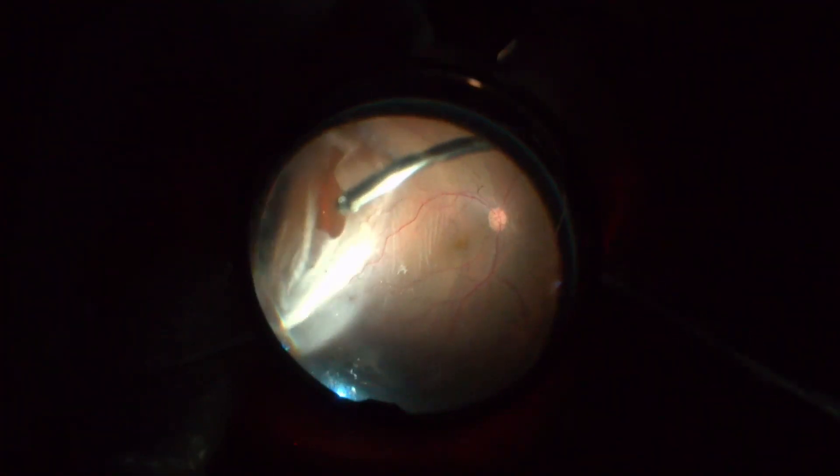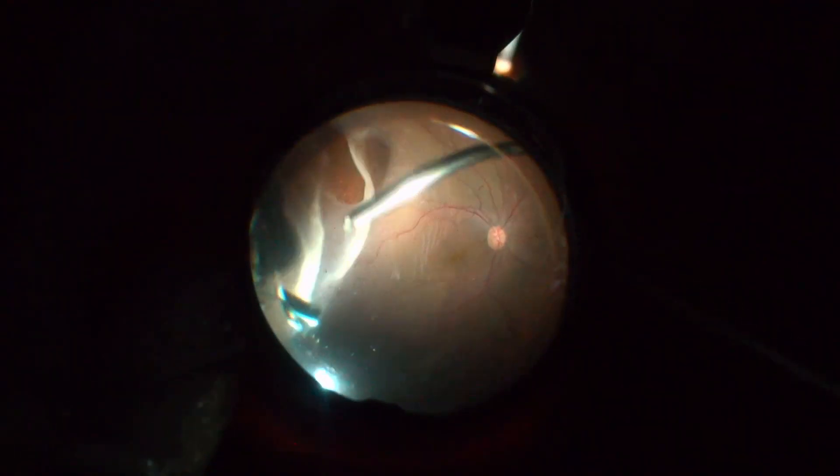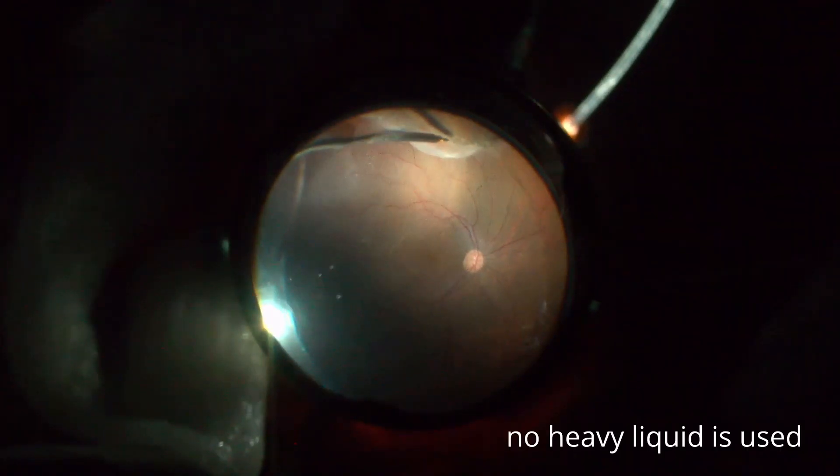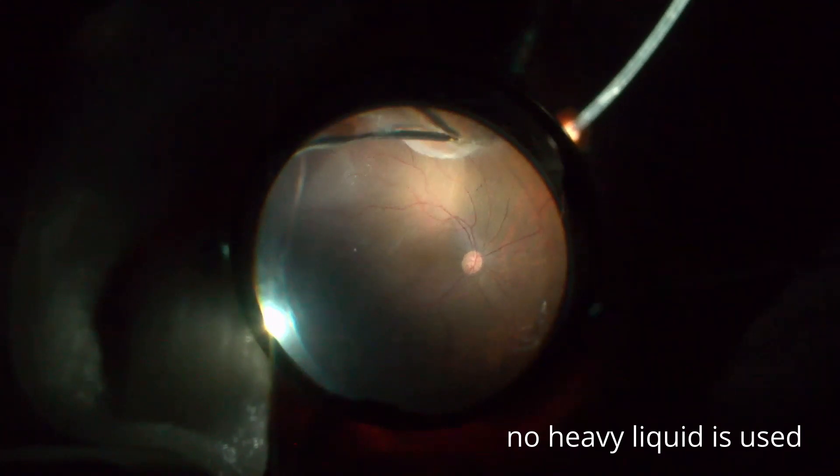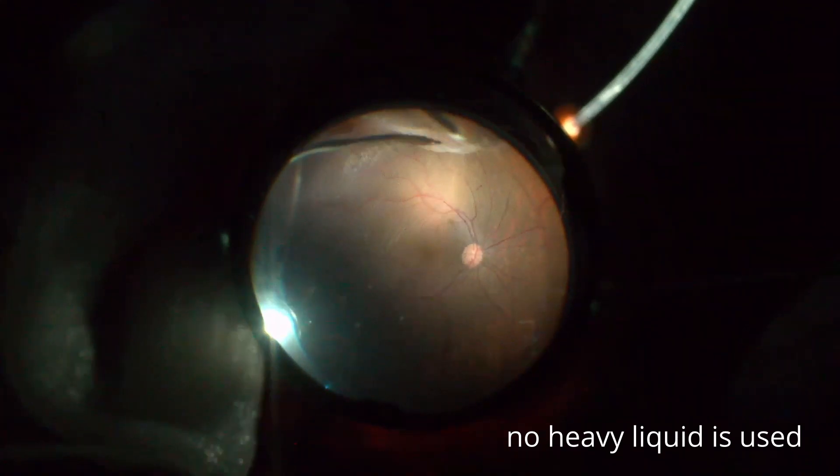Vitreous base excision in 360 degrees followed by anterior hyaloid dissection are, for my part, the most critical steps of this surgery. These procedures are very time consuming but they significantly increase, in my opinion, the success rate of retinal detachment surgery.